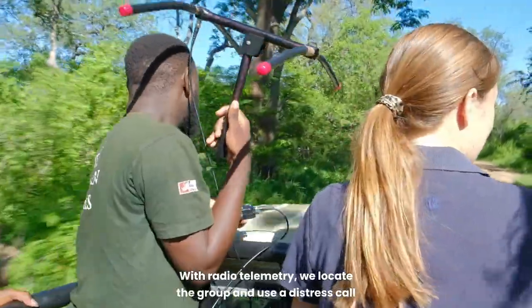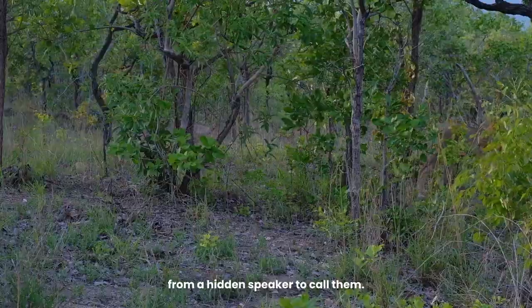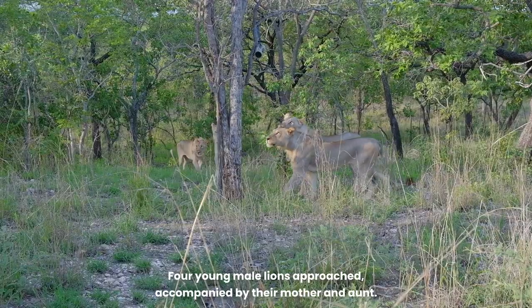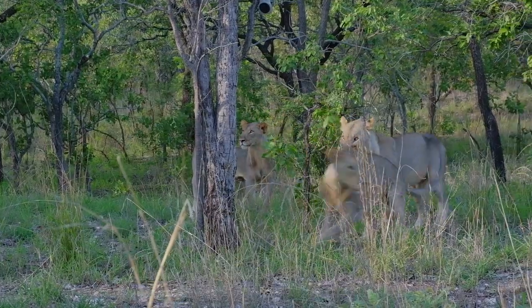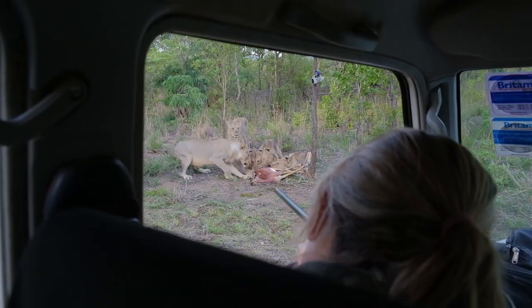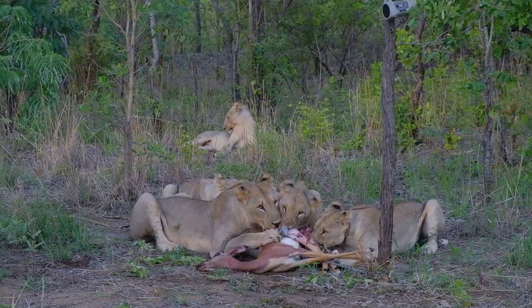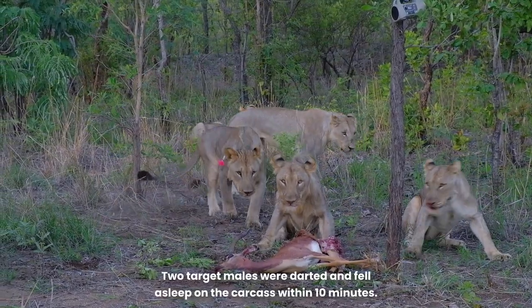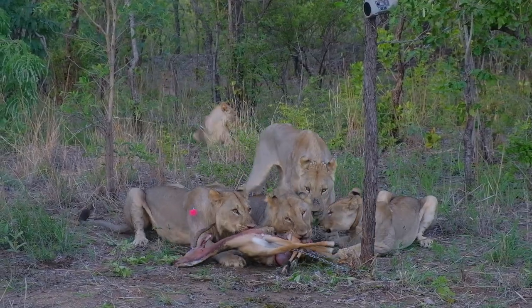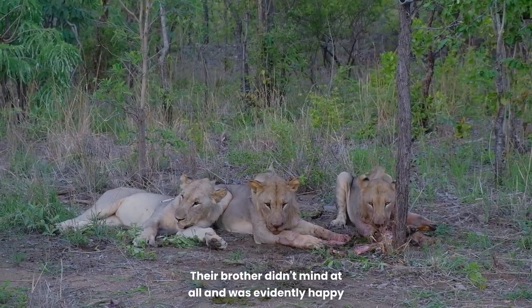Our process begins by identifying target groups using GPS locations from collared lions. With radio telemetry, we locate the group and use a distress call from a hidden speaker to draw them in. This time our plan worked perfectly. 4 young male lions approached, accompanied by their mother and aunt. A securely anchored carcass ensures the lions stay within range for safe darting. Two target males were darted and fell asleep on the carcass within 10 minutes. Their brother didn't mind at all and was evidently happy to have more food for himself.